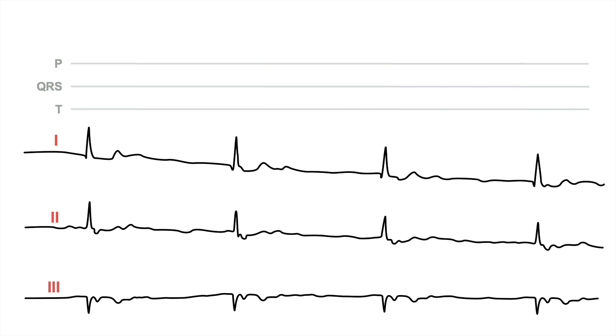Let's have a look at another case. Here again, there are regular QRS complexes. We don't see any P waves. So this again should be midjunctional rhythm, right? Are there no P waves? Let's search for the QRS complexes and the T waves first. Here are the QRS complexes. And where are the T waves? They're here. And then after the T waves, there is this little thing here. What's that? Well, that's called a U wave. You can sometimes observe it in hypokalemia, but then there is another curve that is a little puzzling. And that's this curve here.